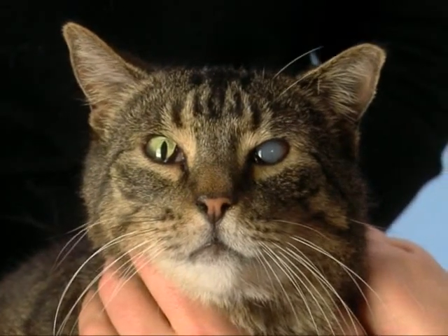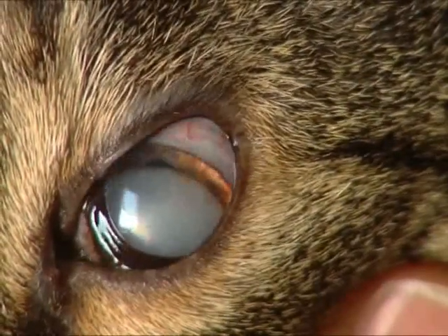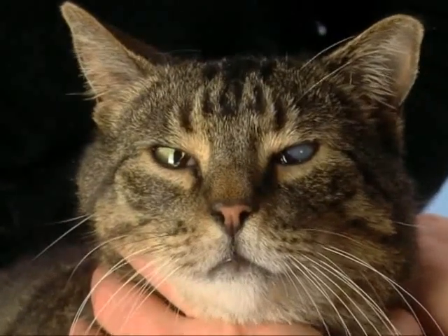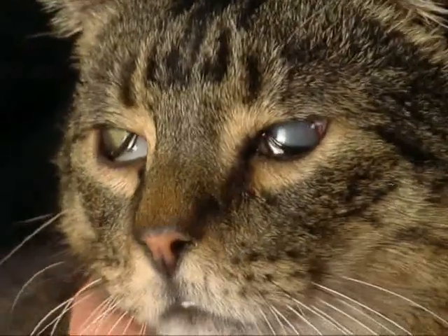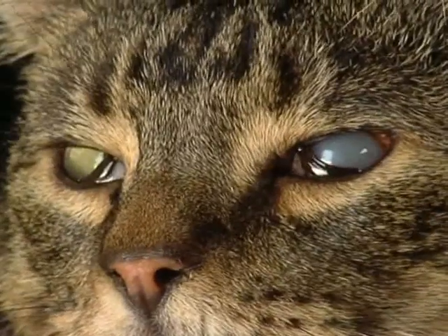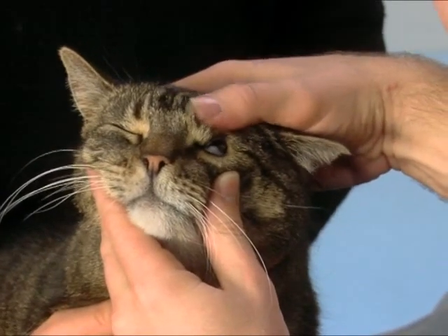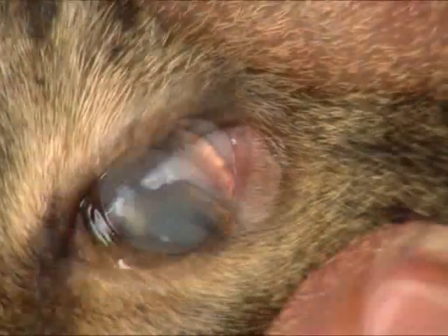This 10-year-old cat first presented with a luxated lens, which has since become cataractous. Distant examination reveals bilateral third eyelid protrusion and mild blepharospasm, suggesting general ocular discomfort. There is also redness in the left eye. On close inspection of the left eye, there is redness in the conjunctiva and also in the iris.